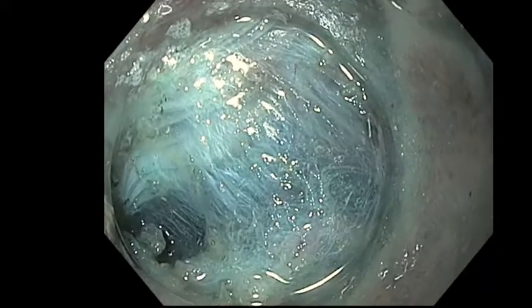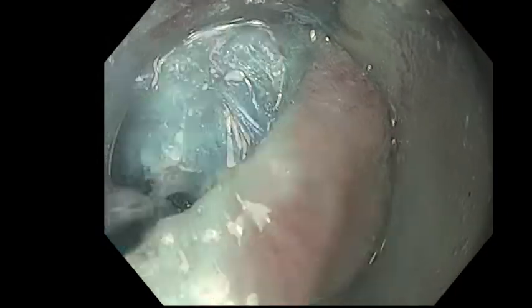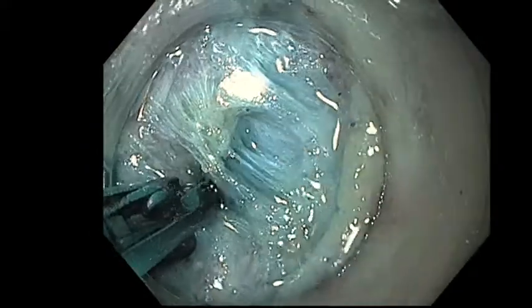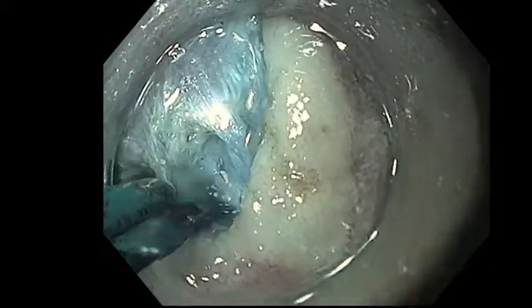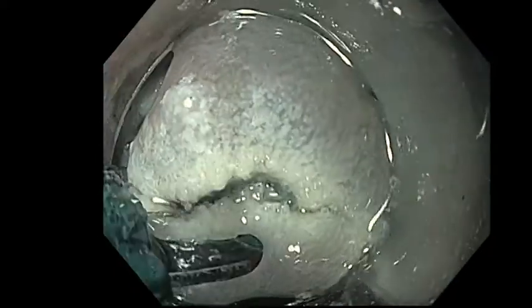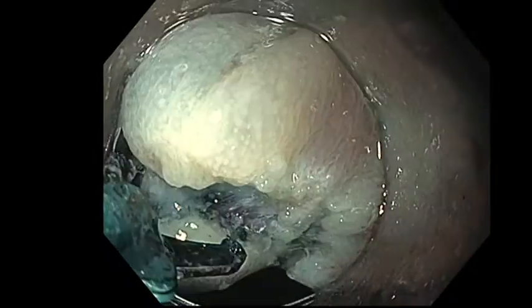Using the lower side of the attachment effectively to fix the tip of the scope for better recognition of the submucosa. Keep dissecting very carefully to avoid touching the muscle layer. The advantage of the scissor-type knife compared to a needle-type knife is that we can perform precoagulation without endoscopic movement during resection, which also makes ESD itself easier. This advantage seems more pronounced when used with a floppy and swaying station as in this case.